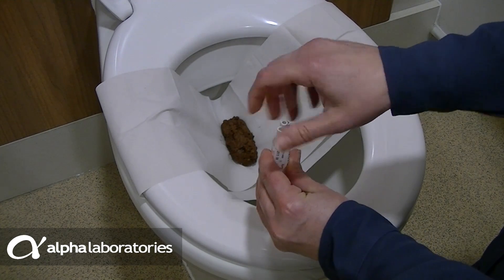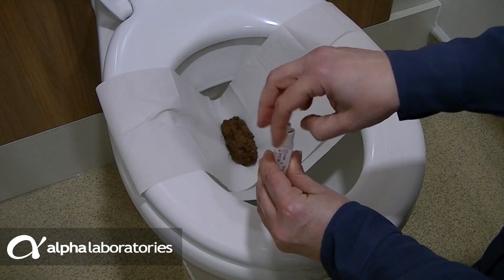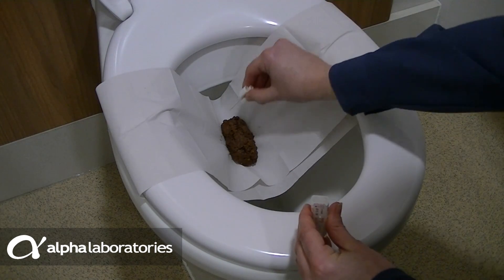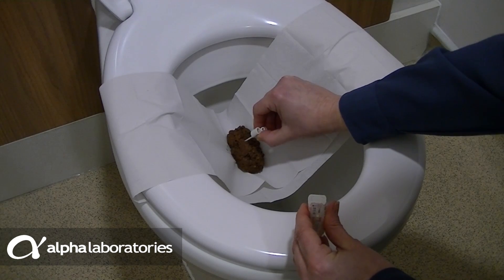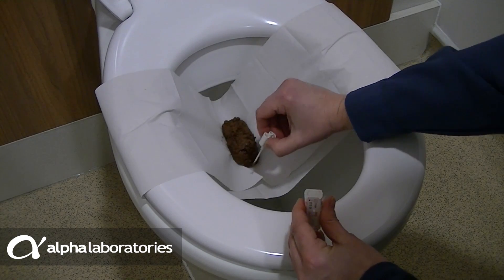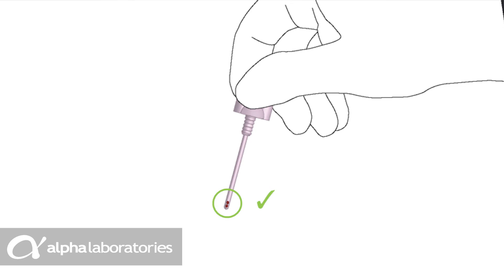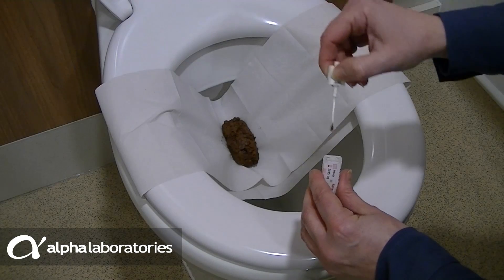Carefully and slowly twist the cap of the sampling device anti-clockwise and pull out the stick from the tube. Dip the tip of the sampling stick into the faeces and draw it across the surface. You may need to do this two or three times to ensure that both dimples on the stick become completely filled.